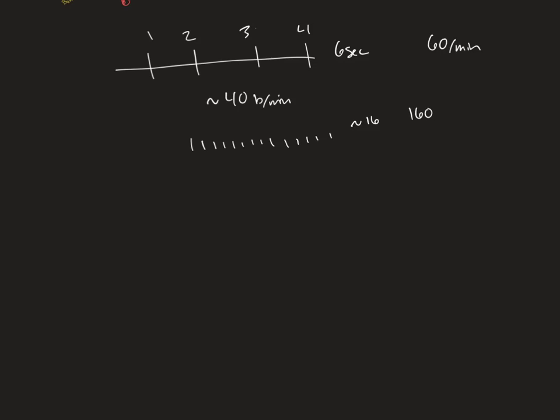Especially the blocks, because blocks require more than one lead to actually diagnose or rule out, is the proper terminology if you're not a physician or an APC. But a rhythm strip is not scaled, so you're not going to get an accurate QRS duration, and you don't have the multiple views that you need to actually show a bundle branch block. So if you see rabbit ears and a kind of wide QRS on a rhythm strip, and you try to tell me that it's a right bundle, I'm going to ask for the 12 lead.